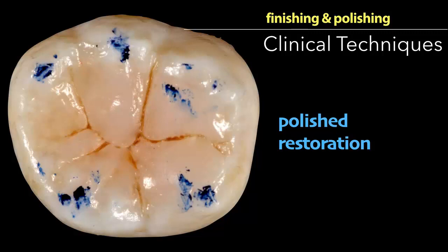Some patients and some doctors ask me, sir, that looks very bad because you are putting a brown tint in a fissure. It looks bad, and we might drill it and consider it as caries, but it's not caries. It's just a stained fissure, and if you have experience, you cannot mistake it for caries. Carious lesions look different. Otherwise there is no benefit in doing such staining.